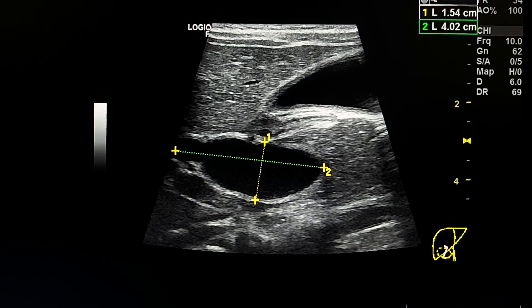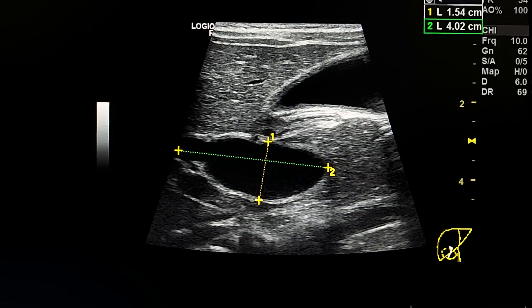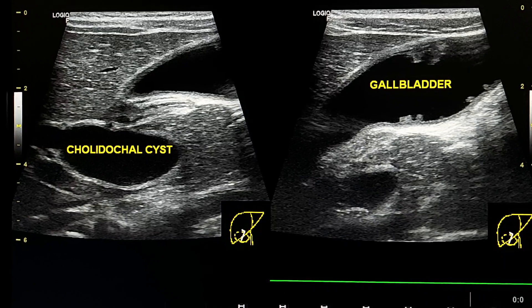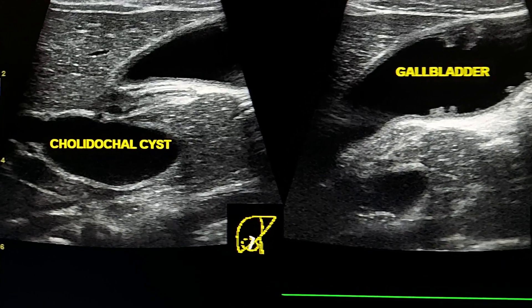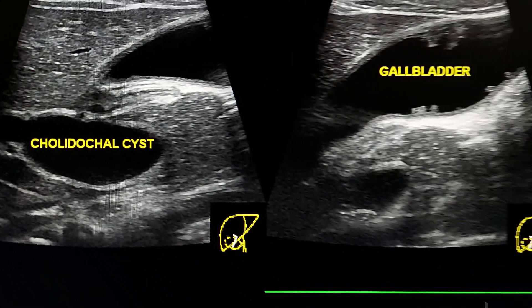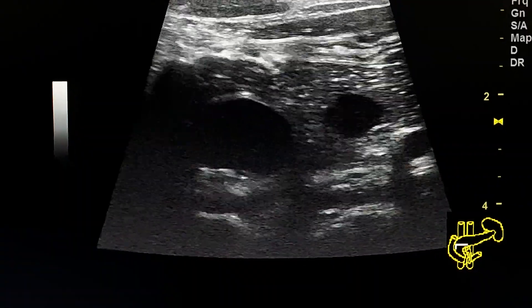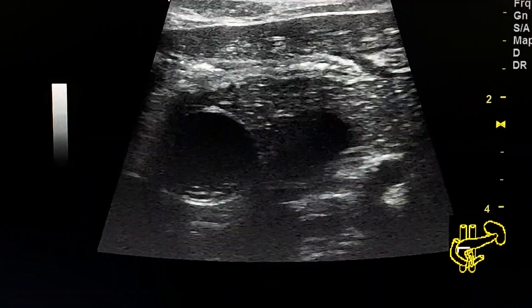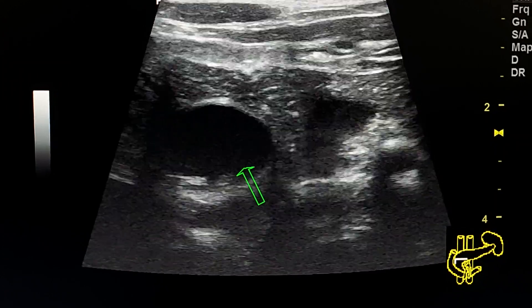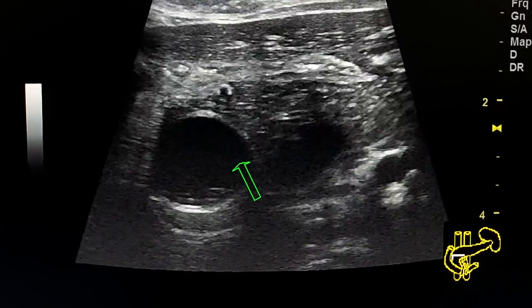These are the measurements of the choledochal cyst. This is the choledochal cyst. This is a transverse section at the head of the pancreas, at the lower end of the choledochal cyst.